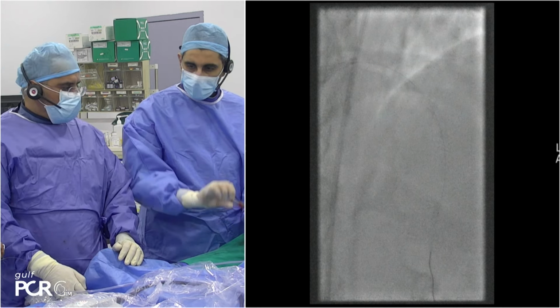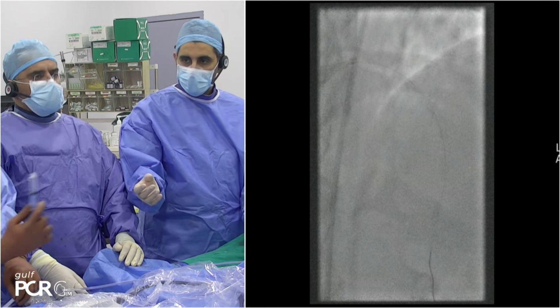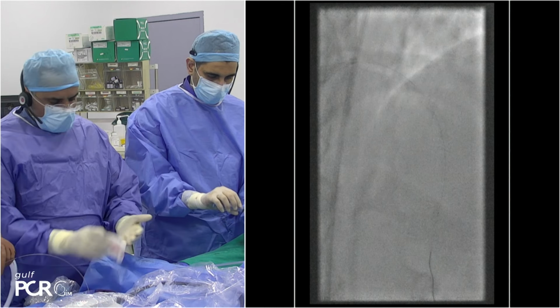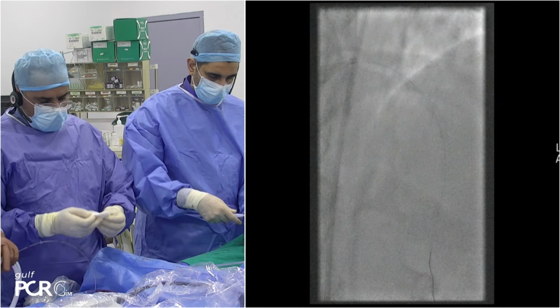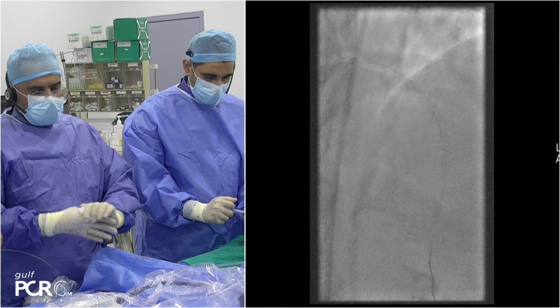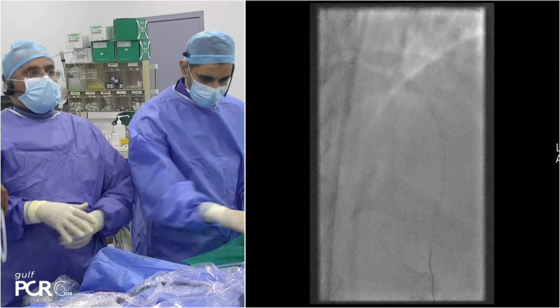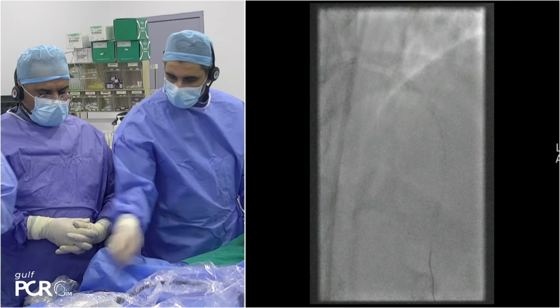I guess one of the immediate concerns that I will have with such a case is safety of the patient as soon as you're done with the procedure. Is he going to have some acute stent closure, edge dissection, or edge occlusion? That would be my immediate concern. And the second concern will be long-term result.